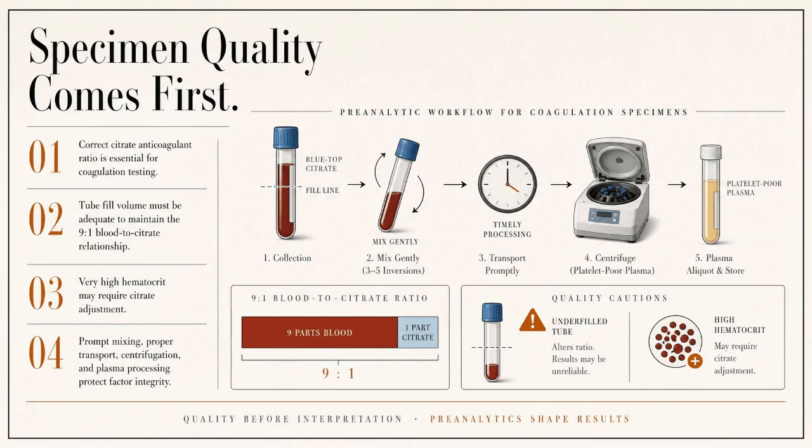We must mix specimens gently and process them quickly to avoid clotting or factor degradation. Hemolysis, lipemia, or prolonged storage can interfere with results. Always ask if the specimen was handled correctly before interpreting an abnormal result. This is foundational for accurate interpretation.